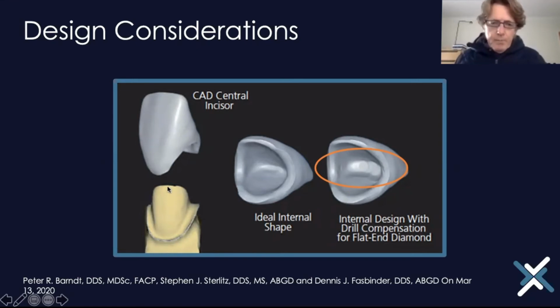But what if your prep is too thin at the top, and the machine is going to create a milling pathway on a certain mathematical calculation where the burr has to move along, then the diamond that cuts the burr might be wider. Remember I said about the 0.6. The diamond might be a little bit wider, or your crown tip is thinner. So in order to produce the negative, you're going to get a problem with your mold over there.